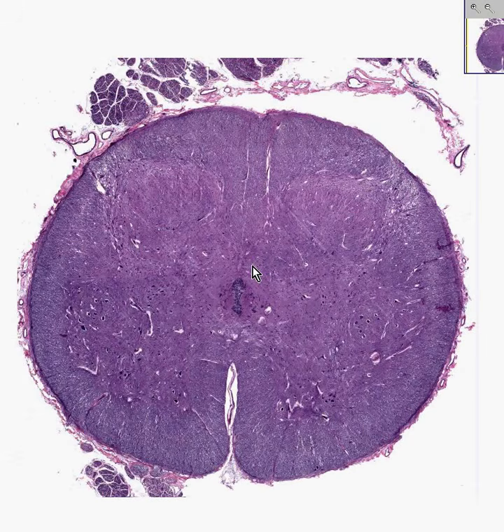Here is the thing that I love to cut the most, both in gross lab as well as in histology lab. It is the spinal cord. Spinal cord is beautiful. It's basically simple as well, no matter what level you cut at. Even though you may cut it at various levels and see various types of patterns, it's basically all the same.